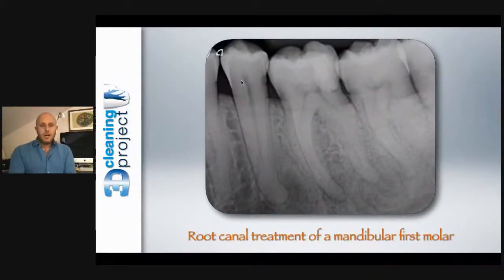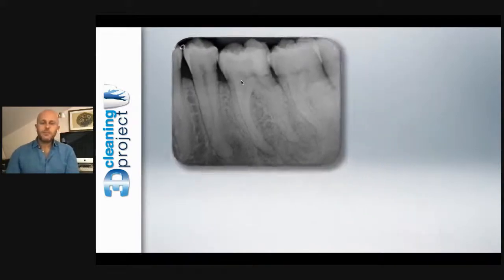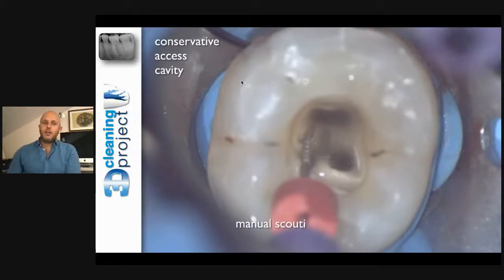And just to finish, a complete root canal treatment, a clinical case. I showed you so many cases, but this is the last one. The root canal treatment of this lower molar with very, very tight canals, but with periapical radiolucency and apical lesion. I did a very, very conservative access cavity. You can see the presence of irrigating solution of sodium hypochlorite as soon as I open the access cavity. And after the opening of the access cavity, I rinse with sodium hypochlorite.